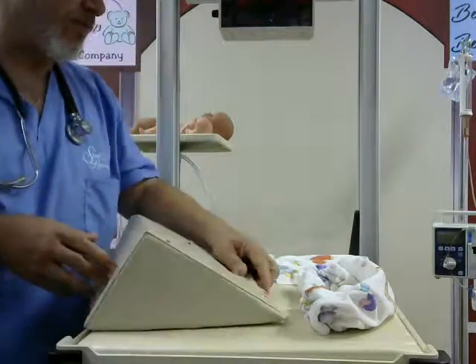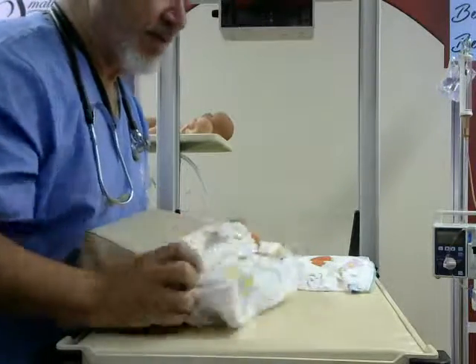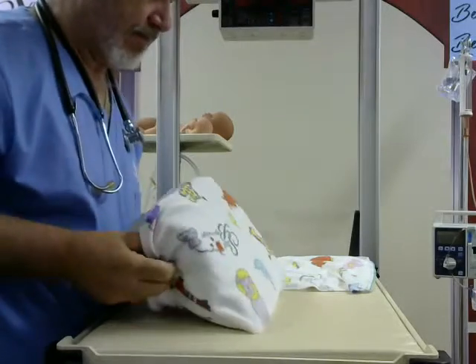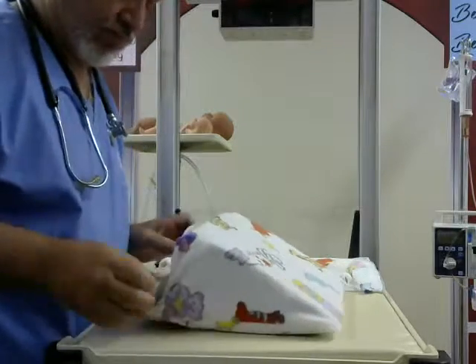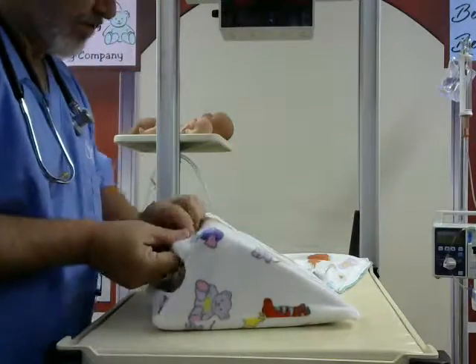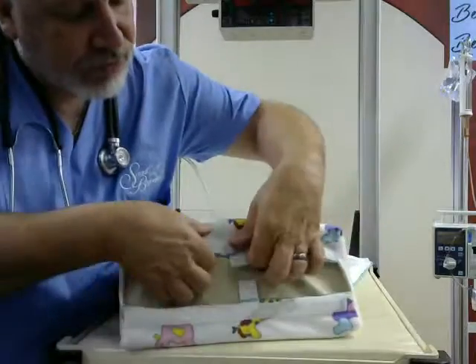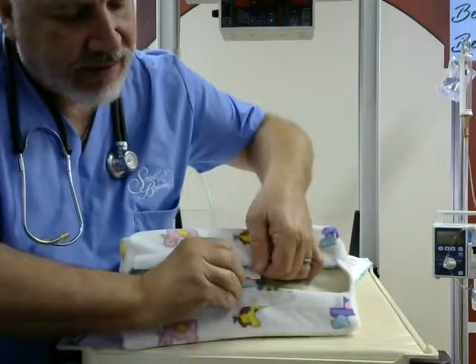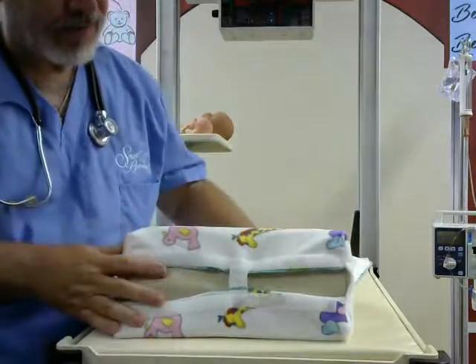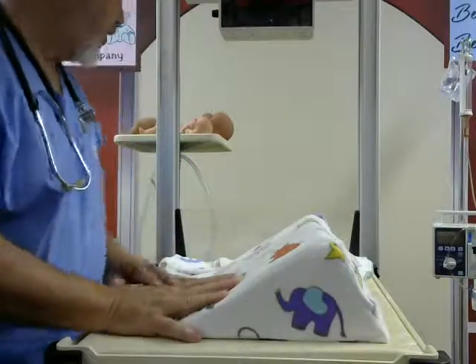Let me put this on. We'll go ahead and get this ready for the smaller baby first, since we're in that position. Pretty easy to put together. You'll notice there's a strip of velcro material on both sides, and then this folds into place like so. Now that this is all secured, we're going to get our baby.